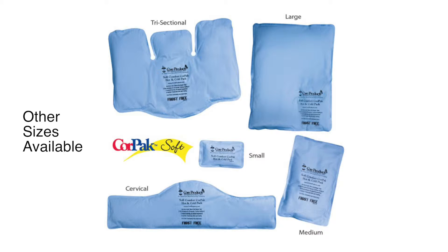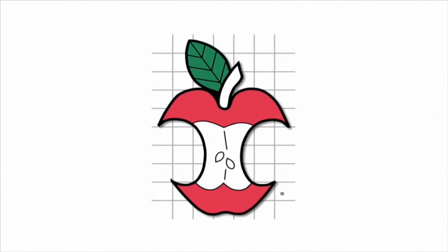The Dual Comfort Core Packs have more fill than traditional packs to help retain cold and heat longer, and they are long lasting, reusable, and filled with a non-toxic, bioperatable fill.